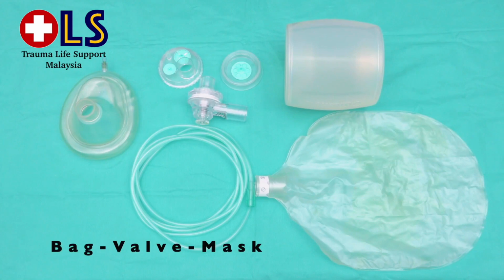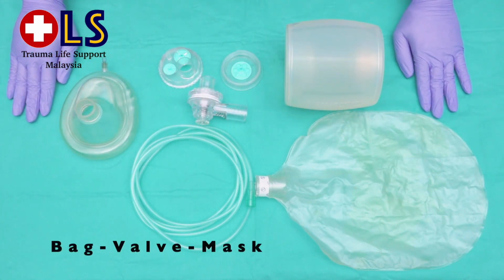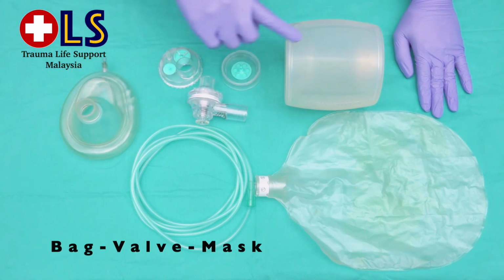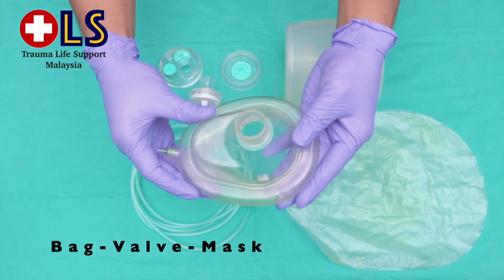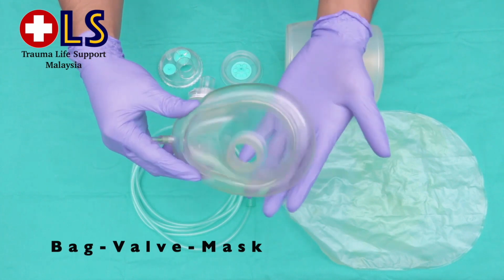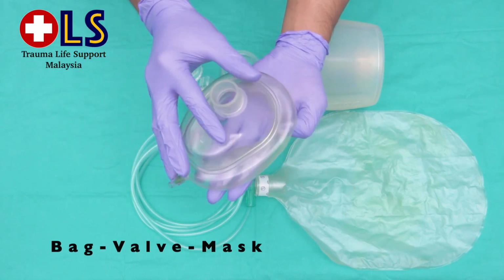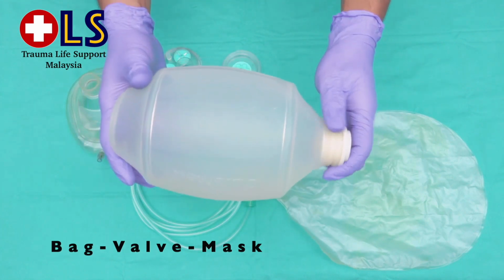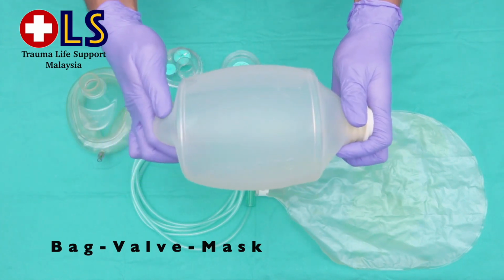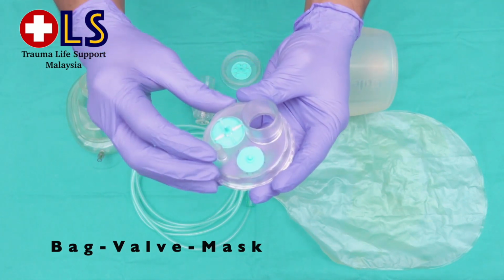This is a bag valve mask device. It is used to provide oxygenation and ventilation prior to intubation. It consists of 3 major segments: mask, bag, and reservoir. This is the mask. It has to be fitted to the patient's face, covering nasal bridge, cheek eminence, and above the chin border. Please choose the appropriate size. This is the bag. It has a few important valves to ensure one-way flow of oxygen supply to the patient. It is called membranes.